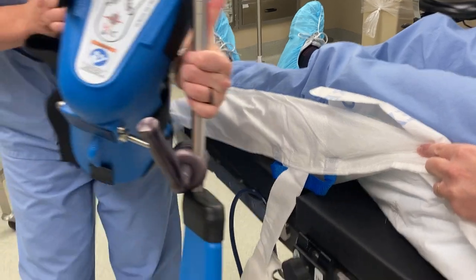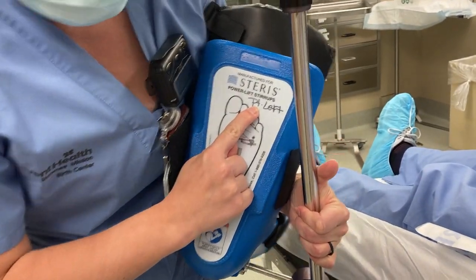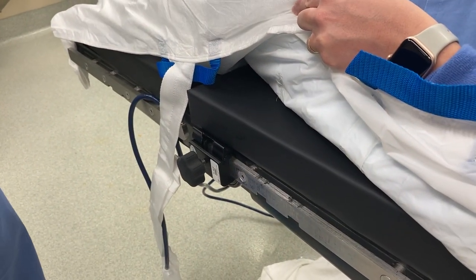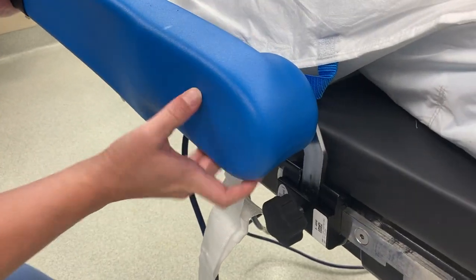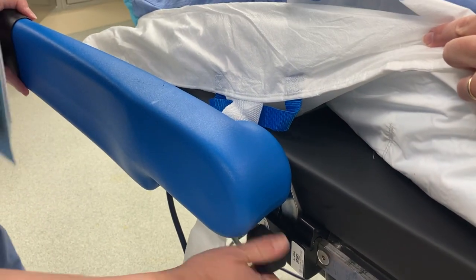Each of the boots has on the bottom whether it's right side or left side — so this is left side. I'm going to take this piece here and clip it down and tighten it.